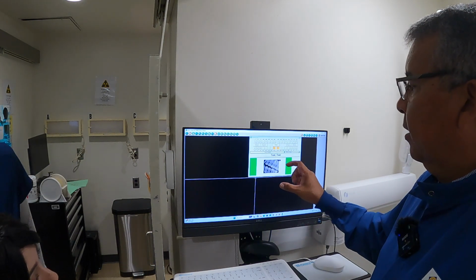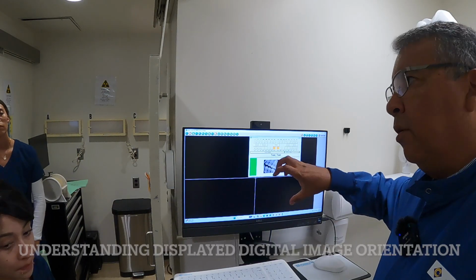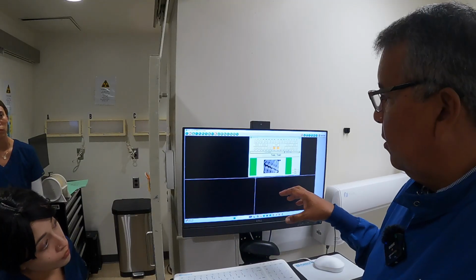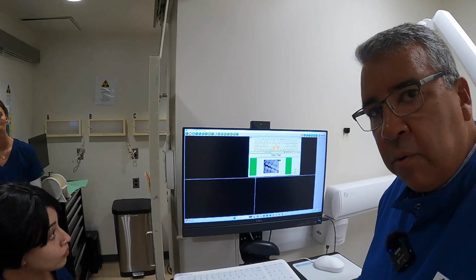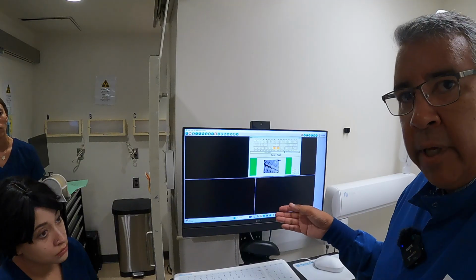Now, sometimes this throws it in a really weird angle. Sometimes it turns it upside down. Sometimes it throws it in reverse. I don't want you to be concerned about that, like, oh, I took the worst picture in the world. We normally wait till we're complete before we go ahead and move on, okay?